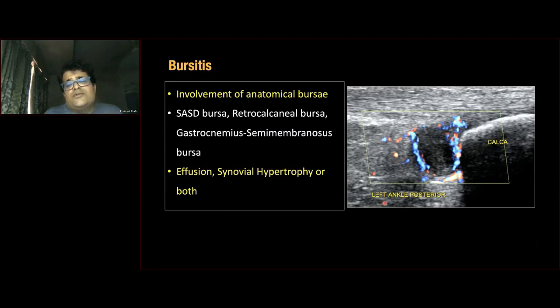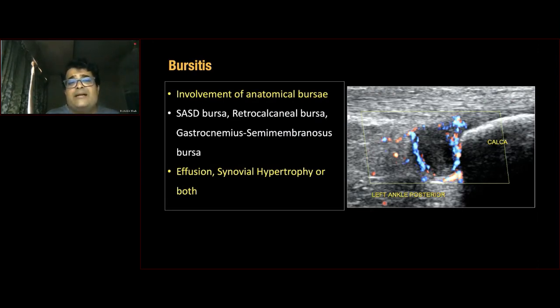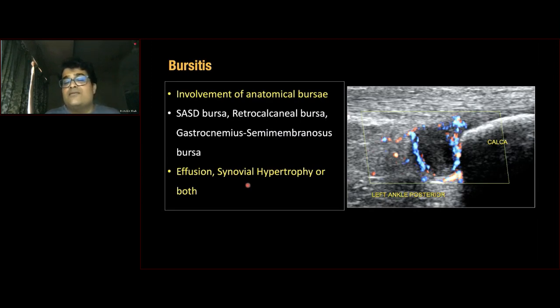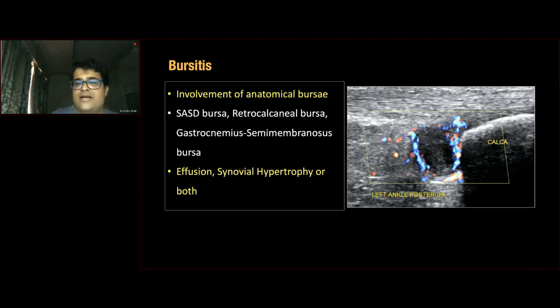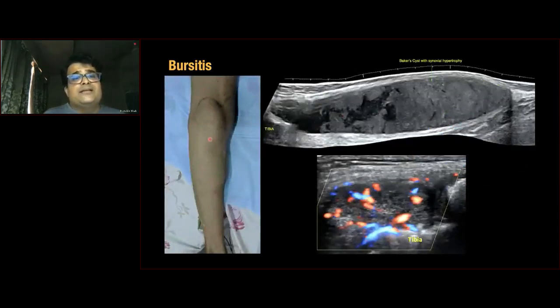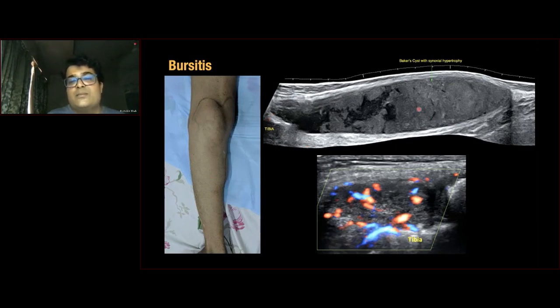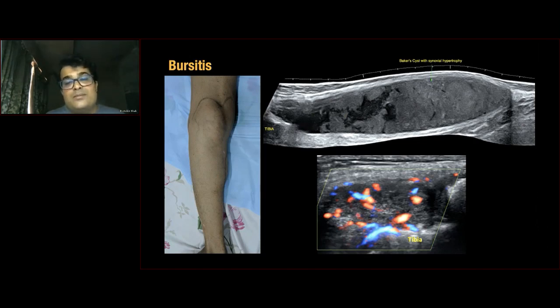Bursitis — virtually any anatomical bursa can be involved, but the common ones are the subacromial-subdeltoid bursa, retrocalcaneal bursa, and gastrocnemio-semimembranosus bursa forming a Baker's cyst. In bursitis you see effusion, synovial hypertrophy, or both, which may or may not show hyperemia. The retrocalcaneal bursa shown has complex tissue with synovium and significant vascularity on HD flow. The Baker's cyst in a known RA patient extends from the proximal tibia all the way down with significant synovial hypertrophy, complex fluid, and marked hyperemia on power Doppler.